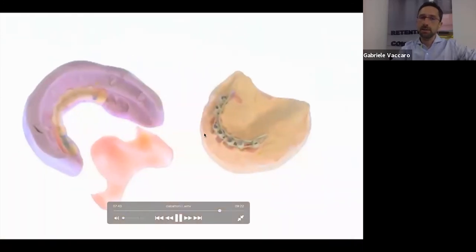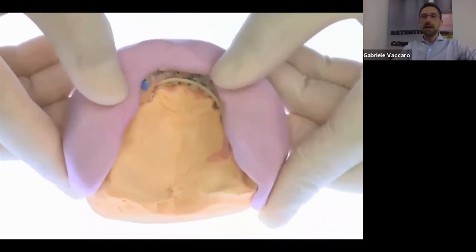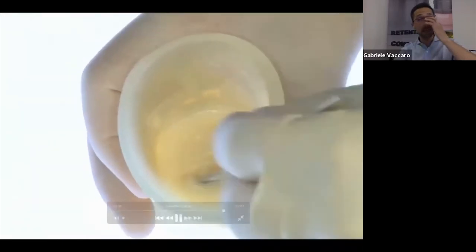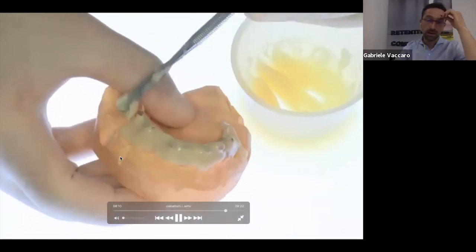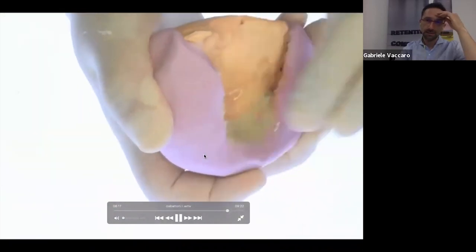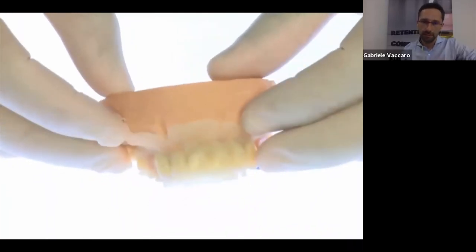Then mask all the metal parts and then mesh together the teeth of the impression tray that we had before, mesh them with the frontal incisor. And then after that, we have this silicone guide that we made in the beginning, that allows us to keep the teeth in exactly the same relationship with the stone, sorry, with the cast. So put the resin inside. After that, you just need to finish and polish the temporary bridge.